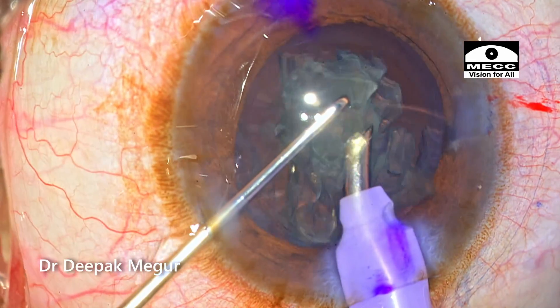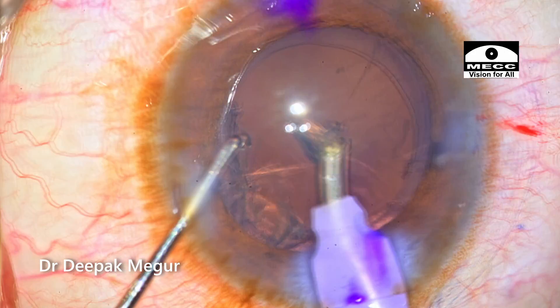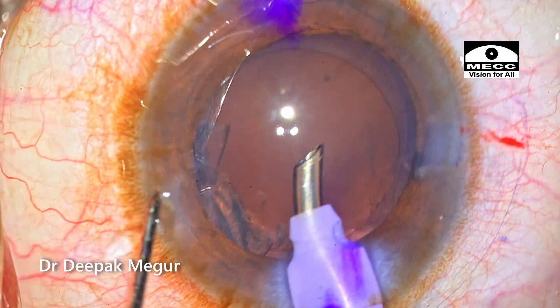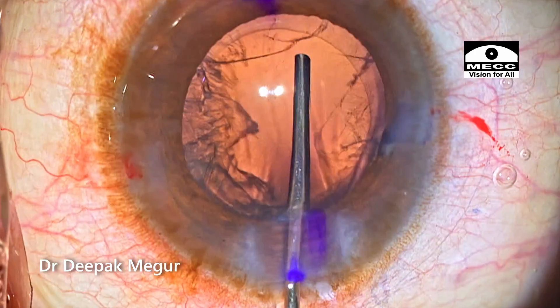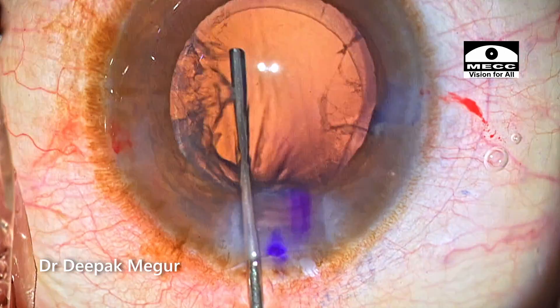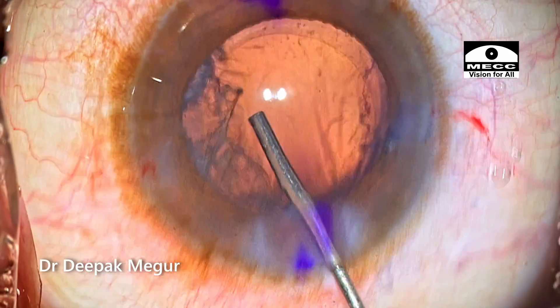As the nucleus gets emulsified and I can get this red glow, now is the time I can really see a small triangular flap which is fluttering. This is the moment in which I actually notice it first. Since it's small, I don't expect it to enlarge anywhere. I'm just using BSS to flush the posterior capsule with one eye closely on the area where the Descemet's membrane is torn.